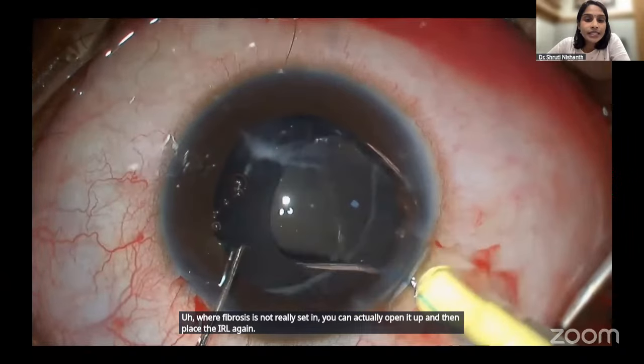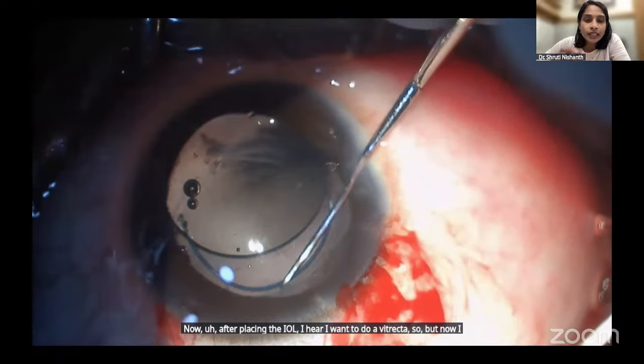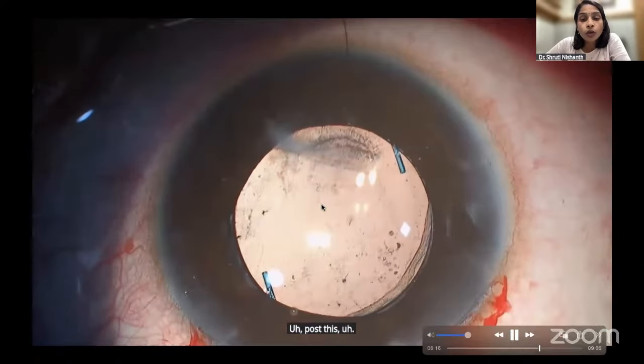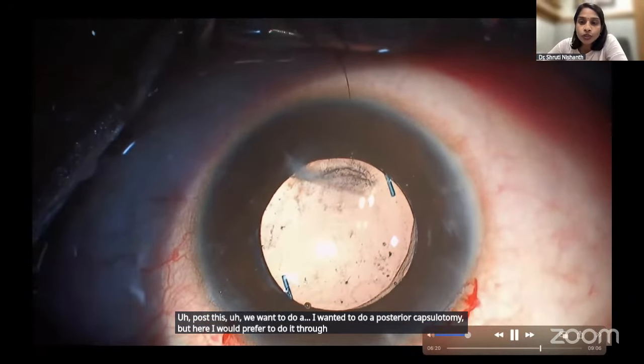Now, after placing the IOL, I want to do a vitrector. But now I just want to show you a very gentle nudging of the IOL, and the haptic goes in beautifully. Post this, I wanted to do a posterior capsulotomy, but here I would prefer to do it through the pars plana route for this child.